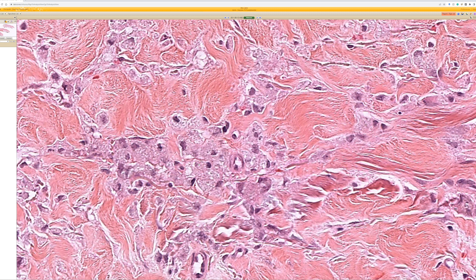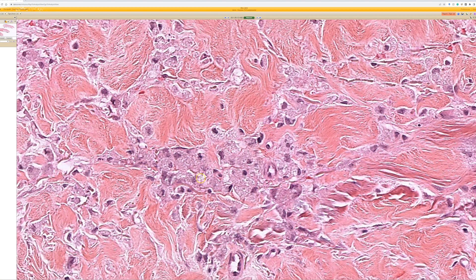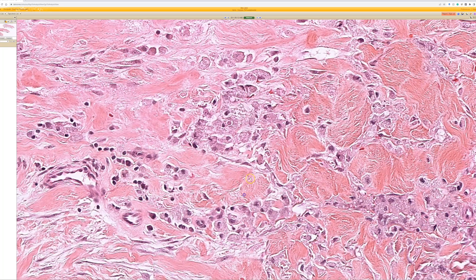These are histiocytes that have phagocytosed the aluminum chloride and eaten it up. Some people say these little speckles in the histiocytes could resemble leishmaniasis or histoplasmosis, which are also intracytoplasmic organisms that live in histiocytes. On a bad day you might mistake these histiocytes for having organisms inside them, when in fact it's just aluminum chloride.